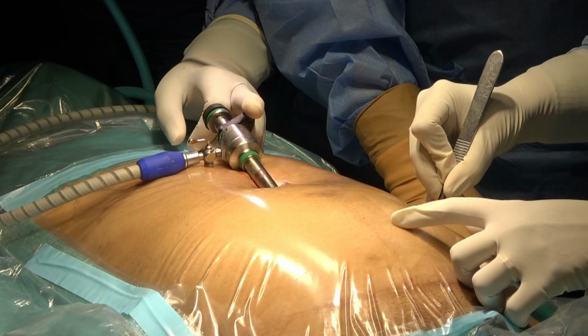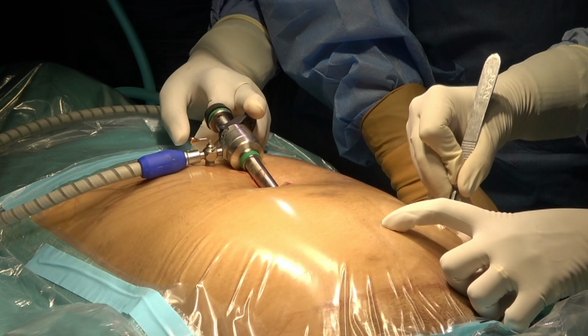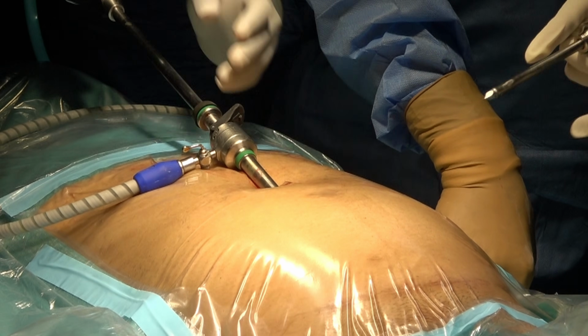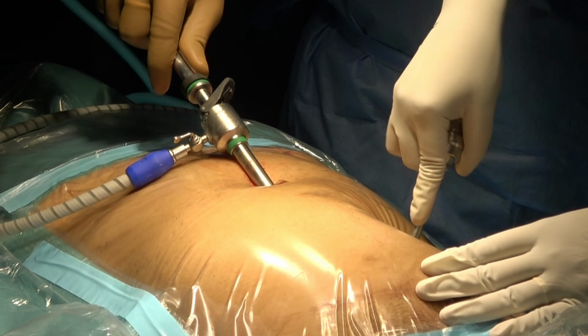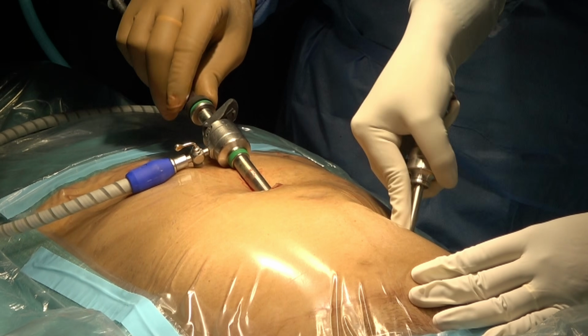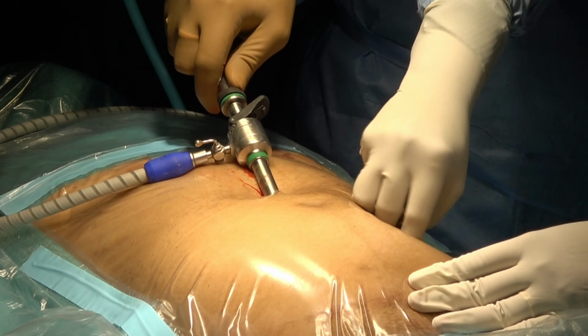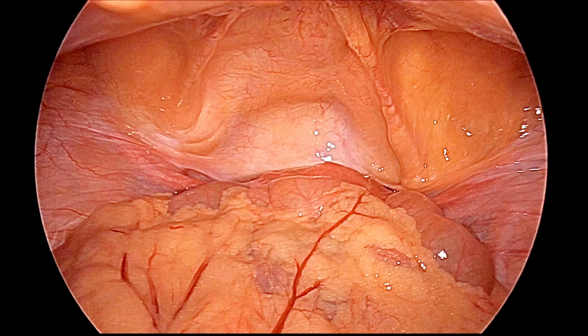So this is the second port, that is 5 mm. Here our assistant is putting the second port, and this is always under vision. So the telescope is introduced, and then the incision is made under vision and the second port is introduced. In diagnostic laparoscopy, as you know, two ports are essential so that you can manipulate the organs, shift the bowel up, and lift the ovary.